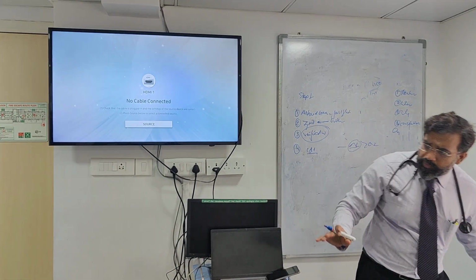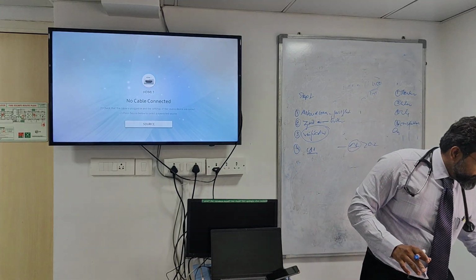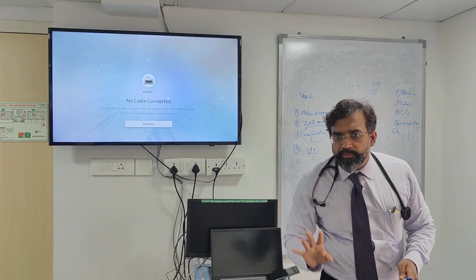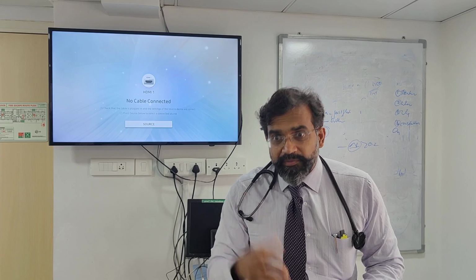So you can use it with normal temperature, but the delta T should be... yeah, you just concentrate on delta T. Is the delta T coming more than 0.2? It should be lesser than our body temperature. It has to be. It will be.